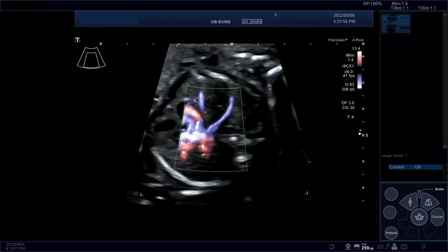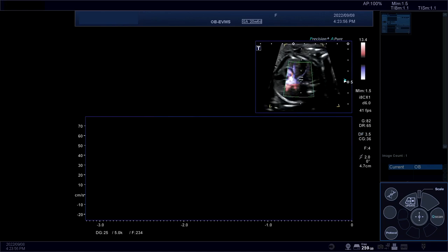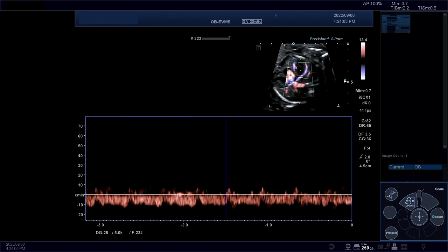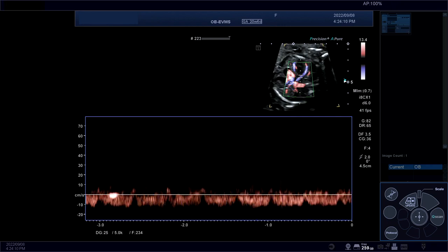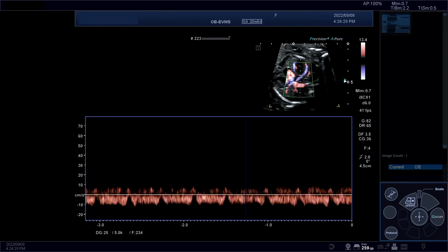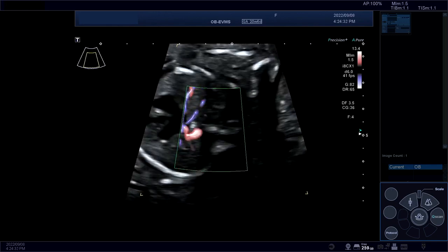It is important to get into the habit of measuring the spectral Doppler of the pulmonary veins and to see the normal spectral Doppler pattern of the pulmonary veins, because that could help you in confirming the pulmonary veins, one, and two, in ensuring that in cases where you're suspicious, I don't see them well, maybe there is a collector vein behind. In many of those anomalous venous returns, there is obstruction to flow, and the pulmonary veins will show an abnormal pattern. And I think we have a lecture tomorrow on that.